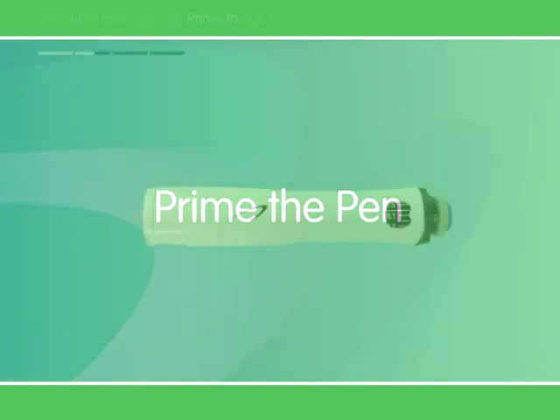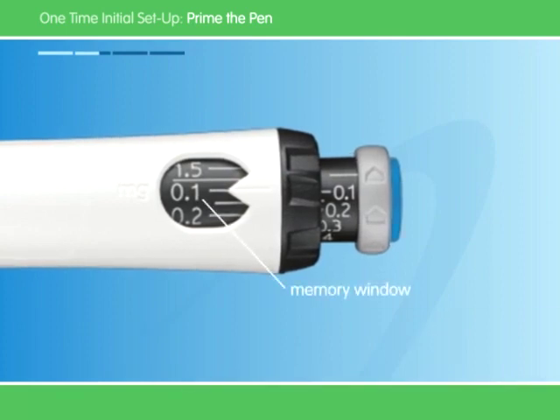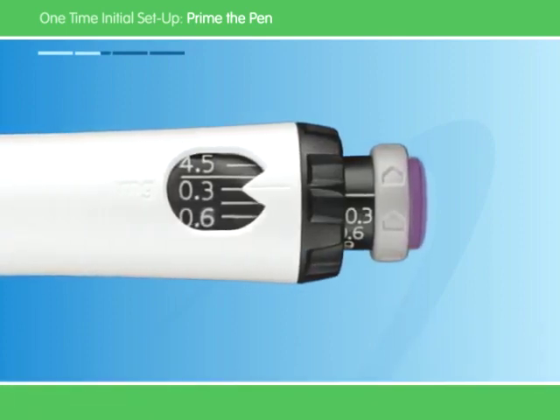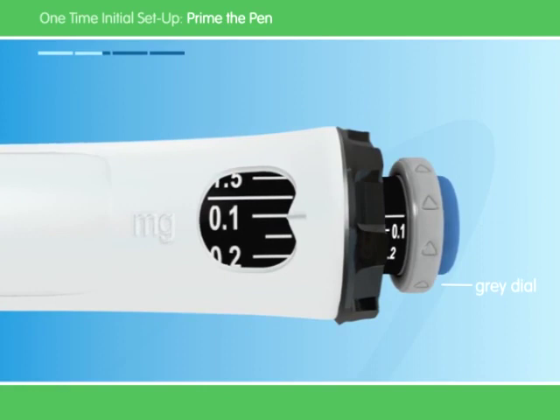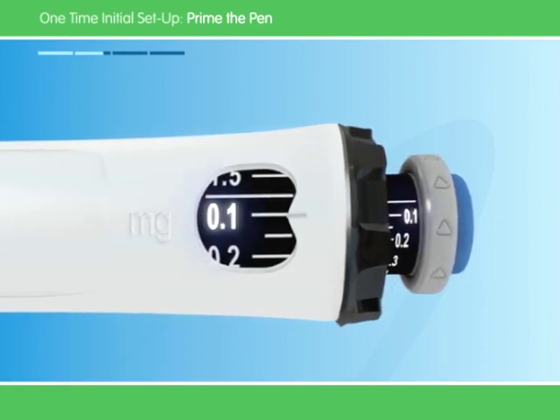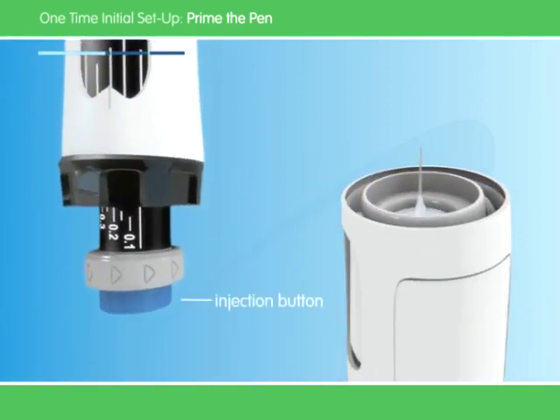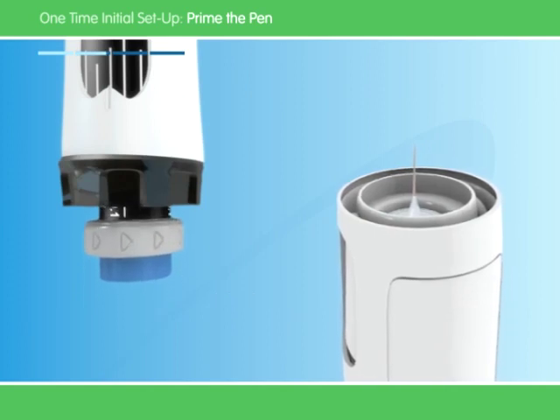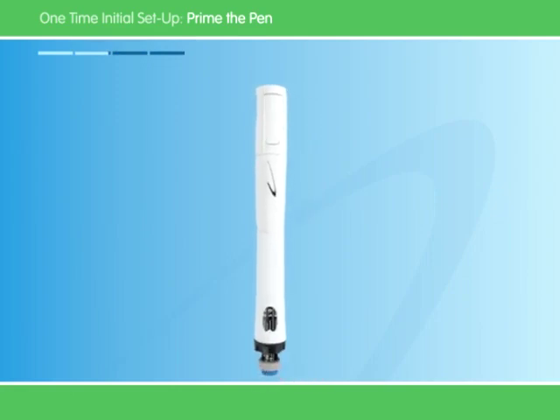The next step is priming the pen, which simply gets the pen ready for use. Begin by pulling off the inner needle cover and throwing it away. Be careful not to touch the needle — not only is it sharp, but you need to keep it clean. When using the Blue Pen, make sure that the number in the memory window is 0.1 milligrams. For the Purple Pen, the number is 0.3 milligrams. After this, turn the gray dial in the direction of its arrow until it won't click anymore. Hold the pen straight up and push the colored injection button. Watch for liquid coming out from the needle at the top. It's possible that the liquid may not appear the first time. If so, try priming the pen again two times. If liquid still doesn't appear, don't use the pen.